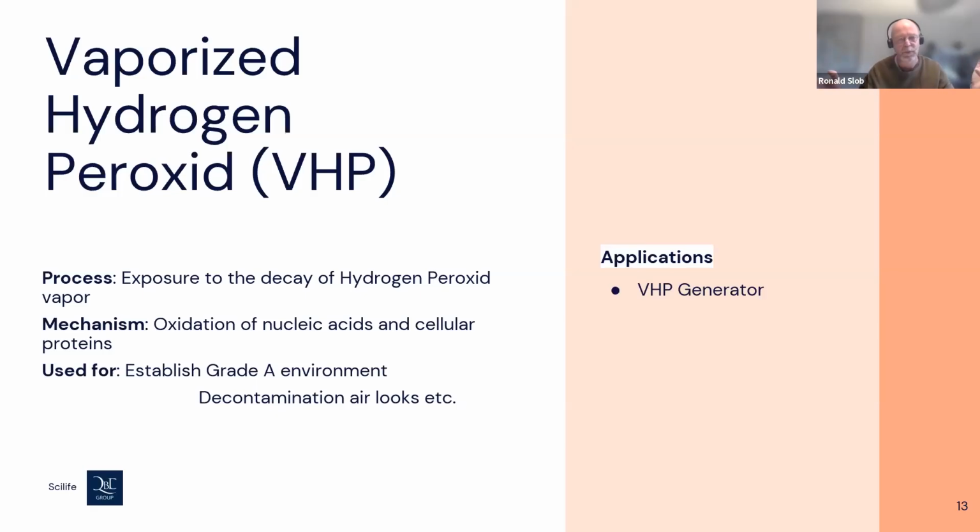And it's widely used now. Steris, I believe, is one of the companies who can supply you with this kind of equipment, to show how you can do this and what you can do with it. It's a very easy way. The main advantage is that afterwards you have water and oxygen, so you don't have any residues after you perform this process.